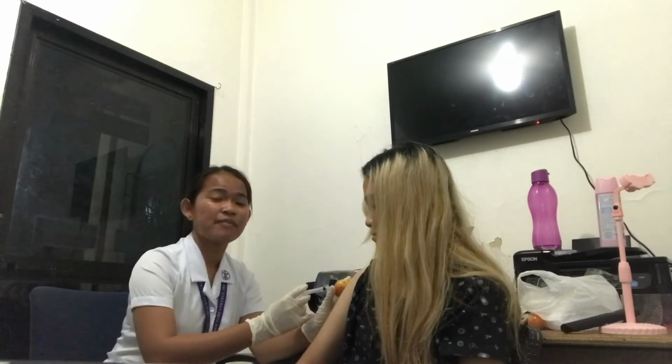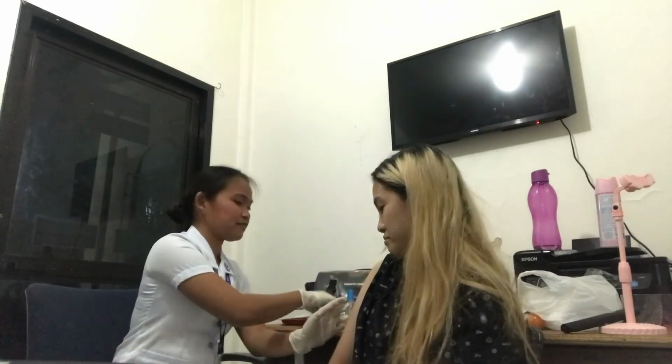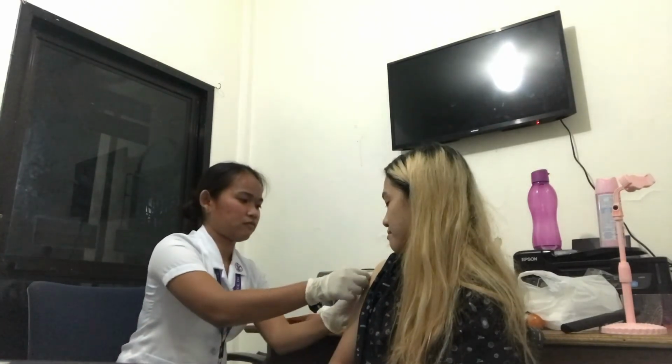So we need to quickly withdraw the needle and place a swab or gauze pad on the site and apply gentle pressure but don't massage. So now we're going to place the patient in a comfortable position and document the procedure. We need to record the time and amount of the drugs on the medical sheet.